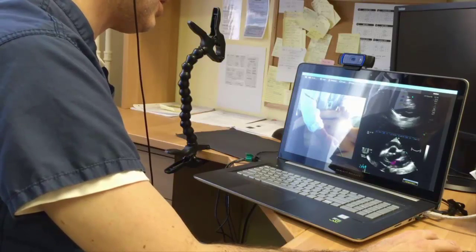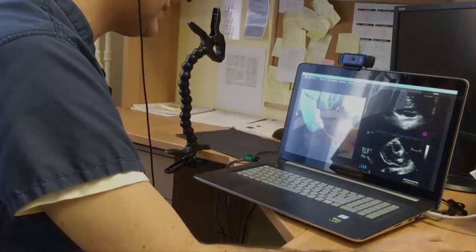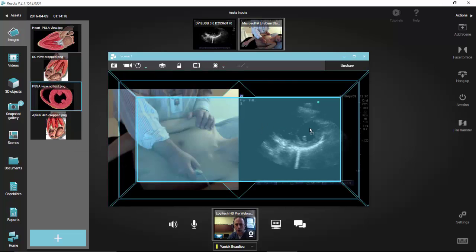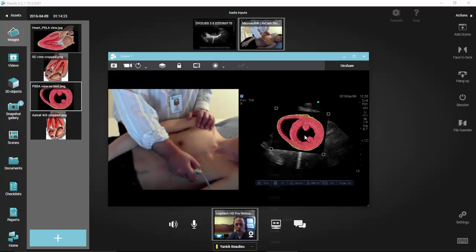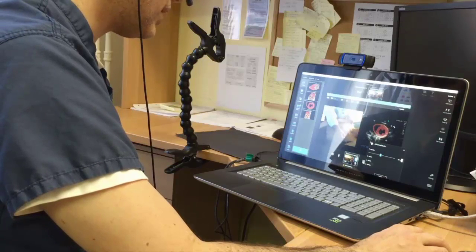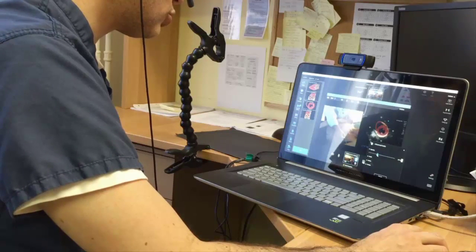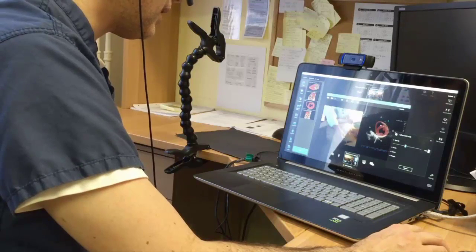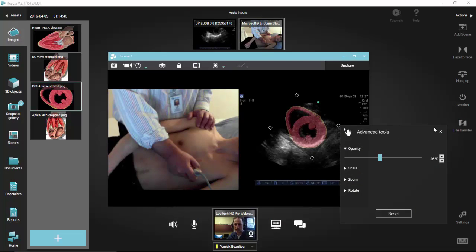And here, if you would have got that effusion, you would have seen it even better on your image because you started at 16 centimeter depth. So as you can see here, I'll superimpose a digital image over your image like this. I'll just put it like that, and then we'll change the transparency. I'll move it so that it's pretty much the same orientation. So you can see that what you're supposed to see is exactly as you're showing it and as I'm showing it. This round, nice left ventricle, and the RV is more of a triangular shape. So we can see that there's a nice function.